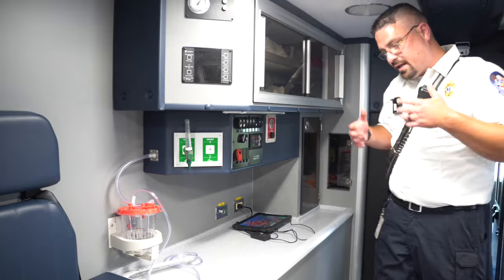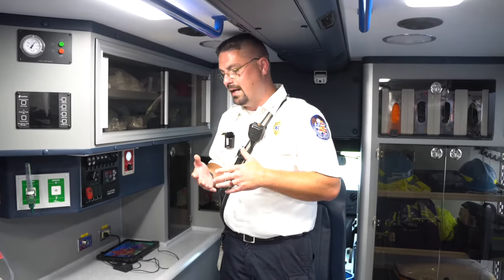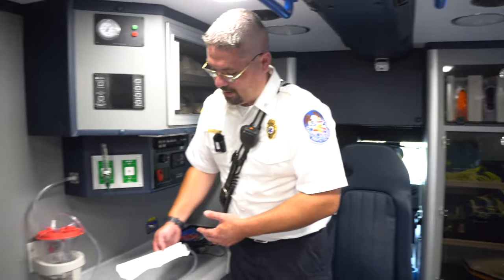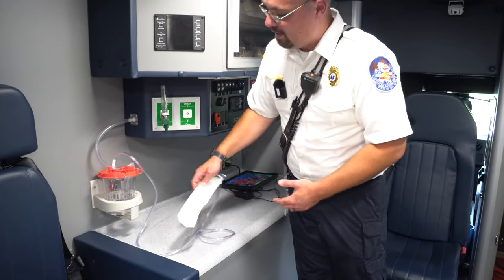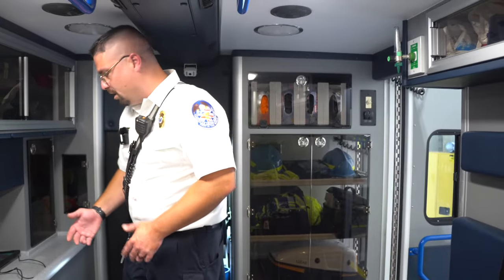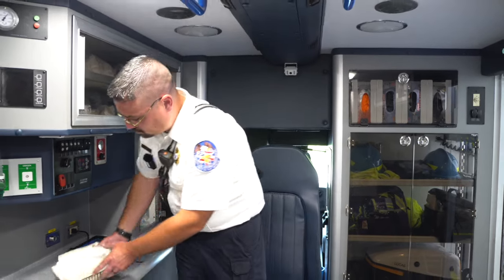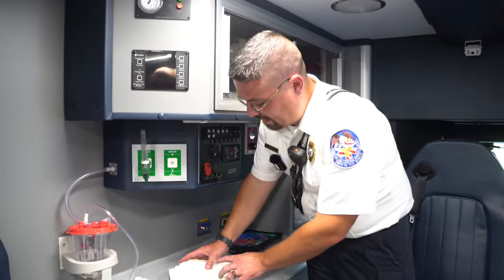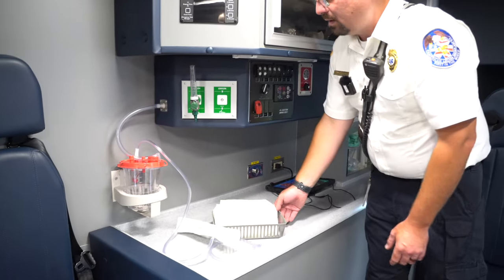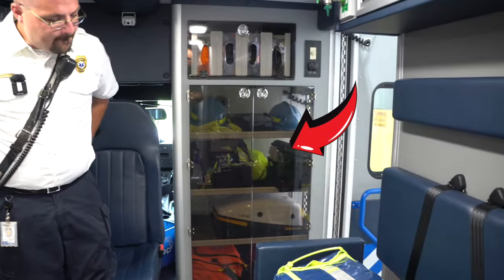Here we have our suction unit. If a patient has something stuck in their throat — whether they vomited, or a traumatic injury left teeth or mucus — we can use this suction and use different tools to clear the airway, collecting material into a clear canister so we can see what we're bringing out. We also have different suction catheters in various sizes — some hard, some soft.